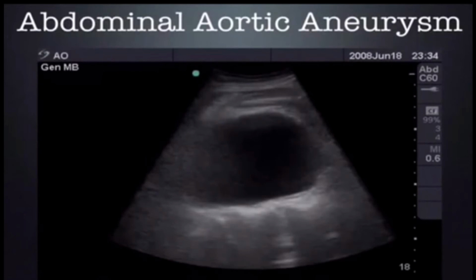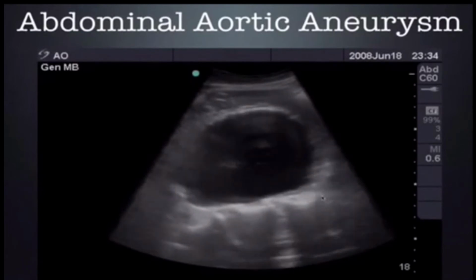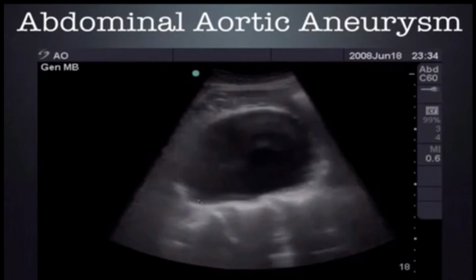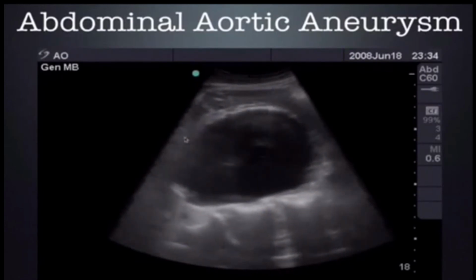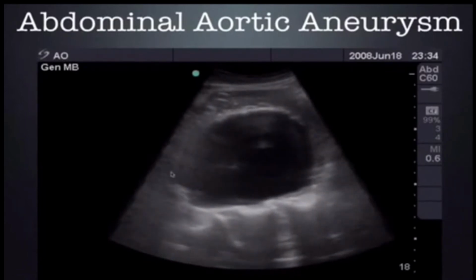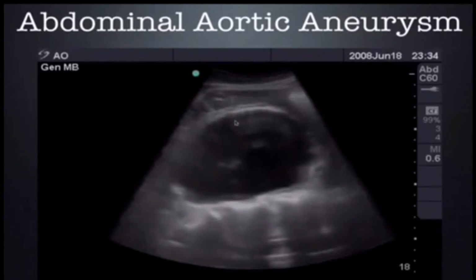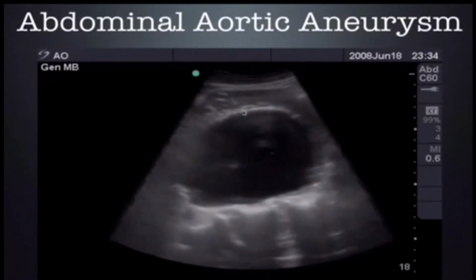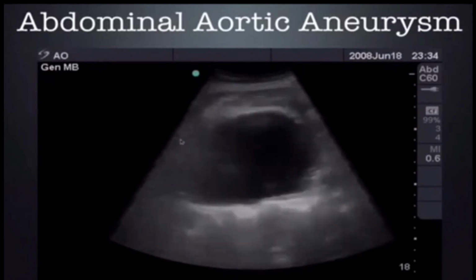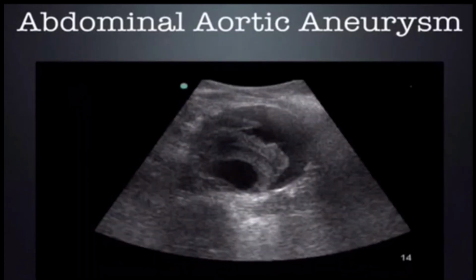Now this is the same abdominal aortic aneurysm, and they've turned the long axis here, and you can see the spine here, and here is the aortic aneurysm, a nice fusiform aneurysm, and you can see that it tapers on either side, and the normal segments of the aorta are hidden in the bowel gas. So again, this illustrates quite nicely that the most anterior portion of the aortic aneurysm is only 2 to 3 centimeters of depth and is quite visible despite the fact there is a lot of bowel gas around this aortic aneurysm. Here's another image.